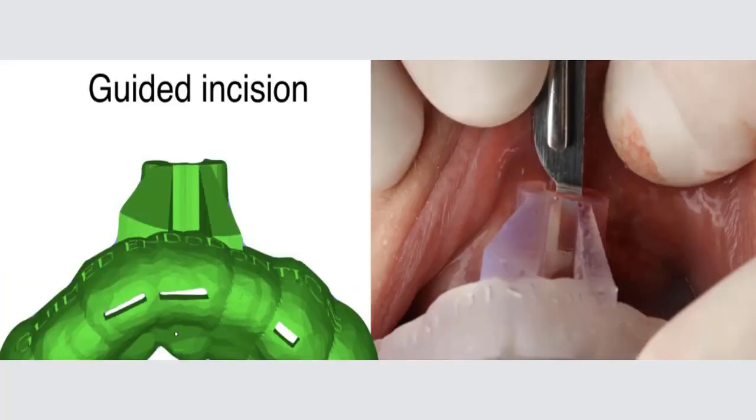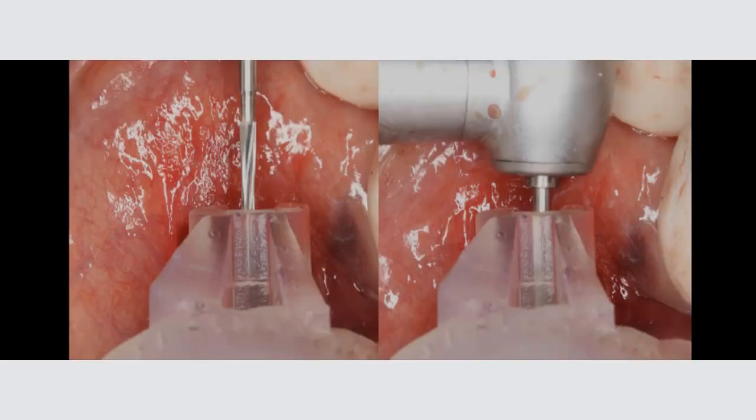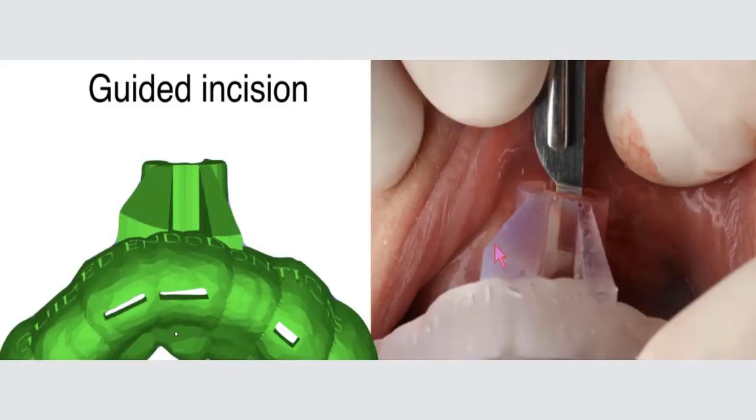But I would like to share that with you, because this will really lead you guys to think on the strategy of scanning several times, on the strategy of using the implant planning as much as you can, on the strategy of combining all this to benefit your patient. So then you go and you drill the patient, you do a little cut, and if I can just go back here, even now we are designing a scalpel guide. Wow. So I'm trying here to combine a scalpel to be guided in the cut, and then I would like to also drill in the right spot.